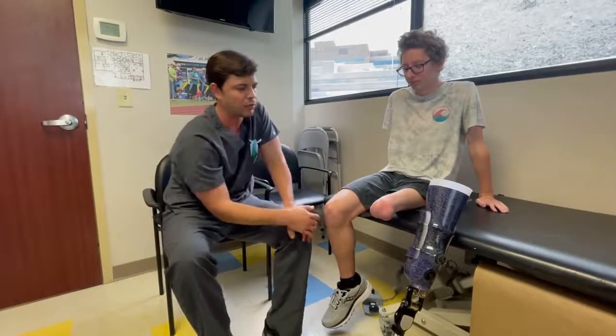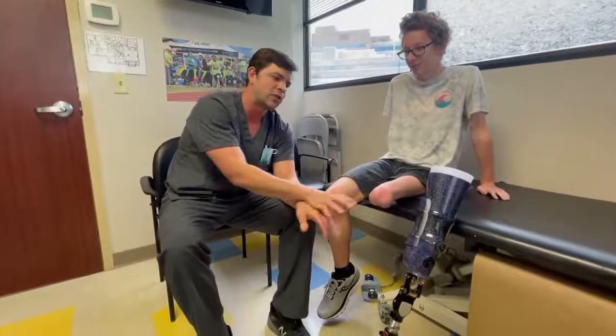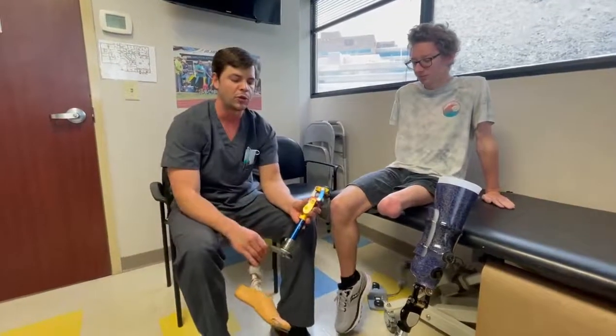He's been wearing his leg all morning and just took it off for this video, so you might notice some redness from the suction valve — that's pretty common. Redness lasting longer than 30 minutes might be a sign of concern, but that's not the case here. As you can see, his leg is very bony, so with an expandable-wall socket he can push past the condyles. He had a little difficulty with that at first two years ago, but he's since toughened up and is doing really well.